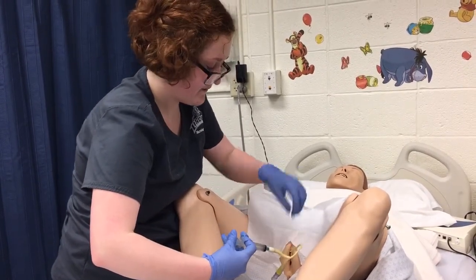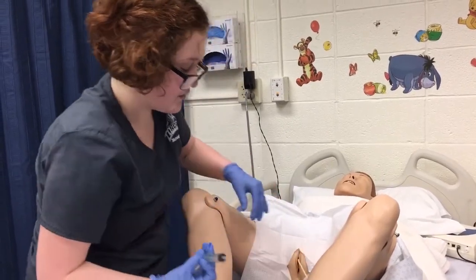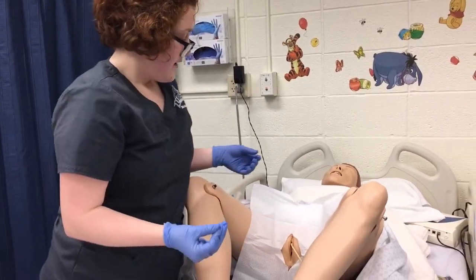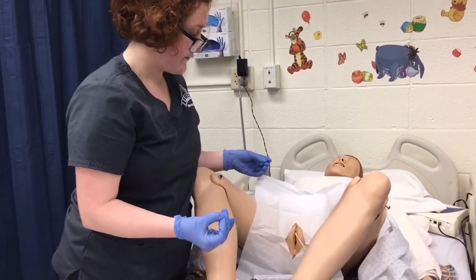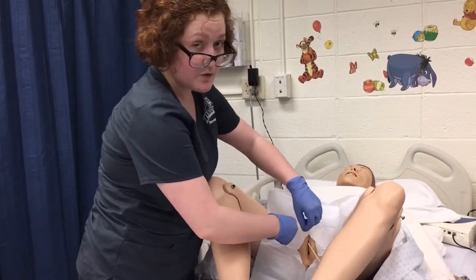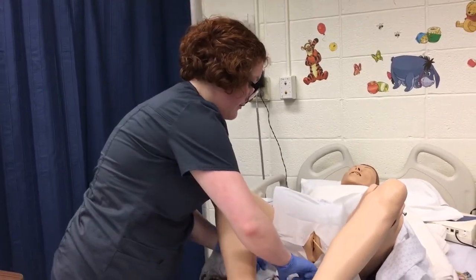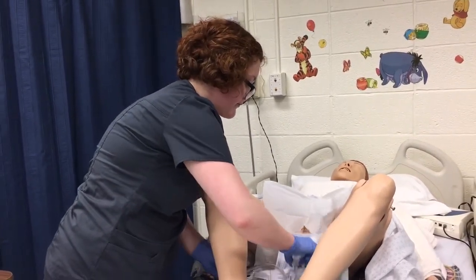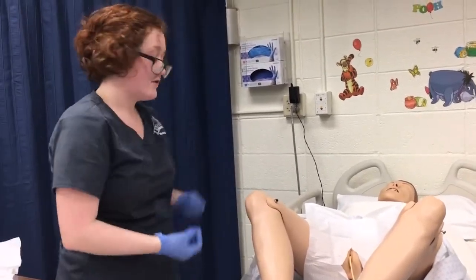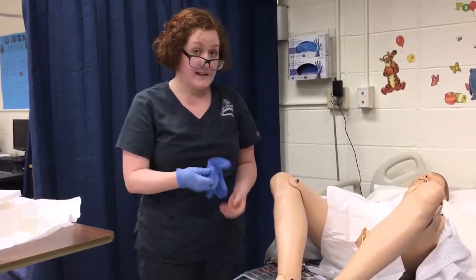Once it's inserted, I can let go with my non-dominant hand, remove the syringe and discard. Then I would tear this and remove it from the field. I would remove my sterile gloves, wash my hands, and apply clean gloves.